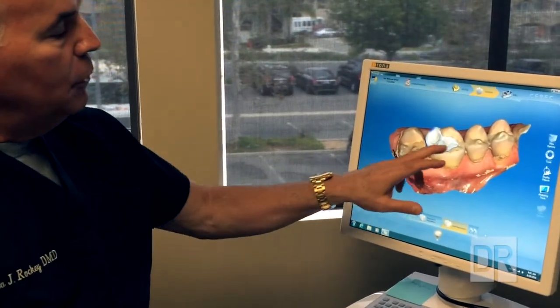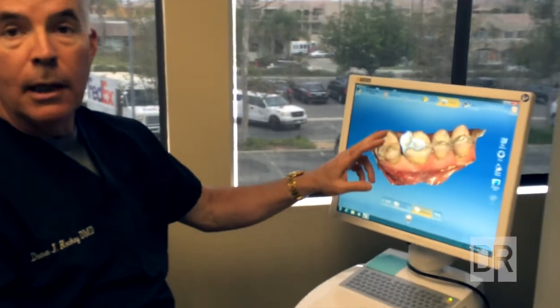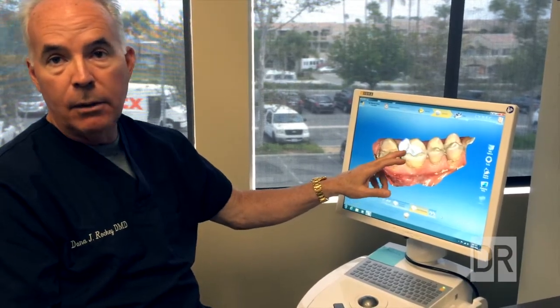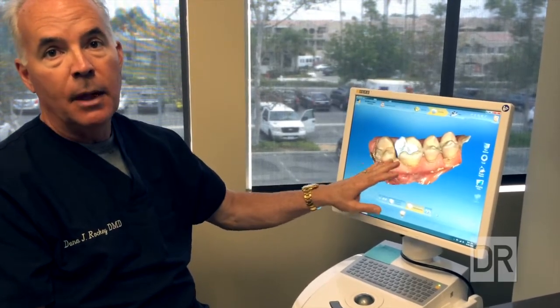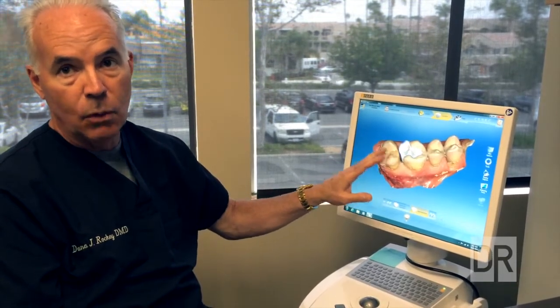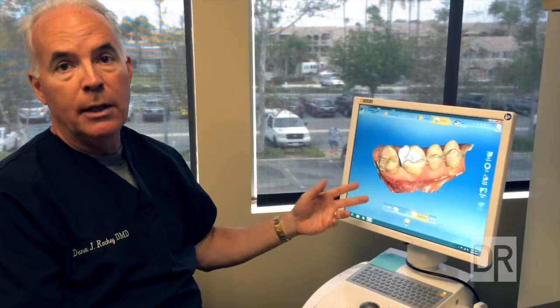Here's the solution that the computer proposed, and then we can wirelessly send that to the mill in our laboratory. The mill will actually grind that piece within a matter of 10 minutes or so, depending on its size. We can bring that back to the patient chair with the patient waiting, tooth still numb, still in the dental office in one visit, and we can glue that in, trim it, polish it, and send the patient out with a tooth that is finished in one day.